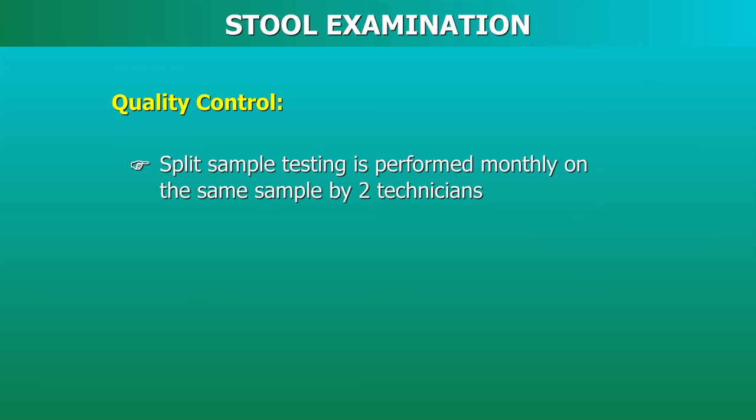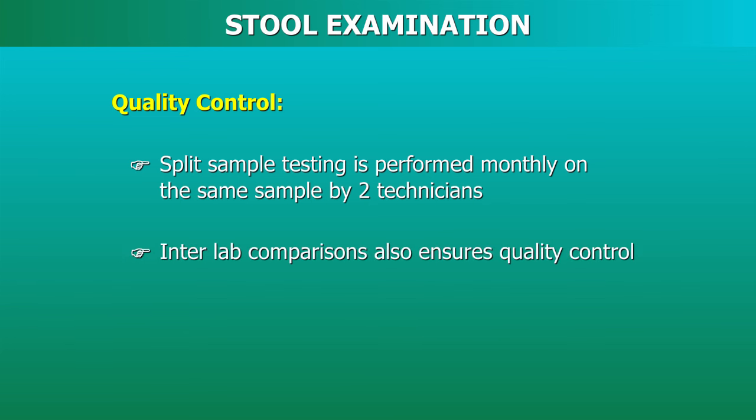Quality control. Split sample testing should be performed monthly on the same sample by two technicians. Inter-lab comparisons is another method of ensuring quality control.